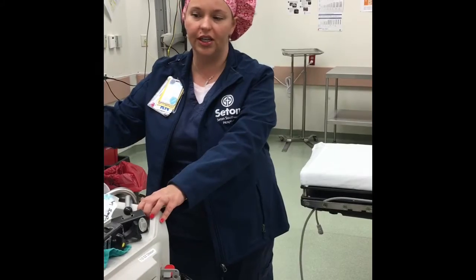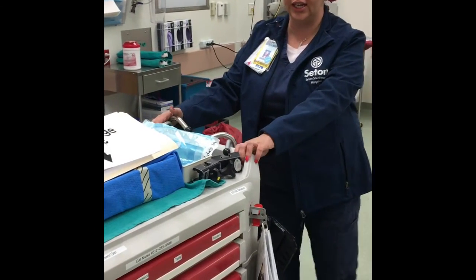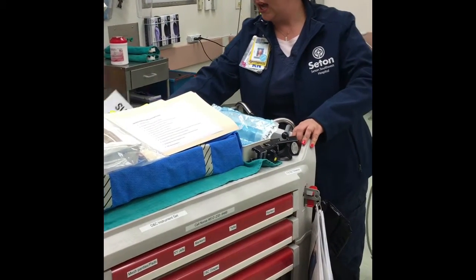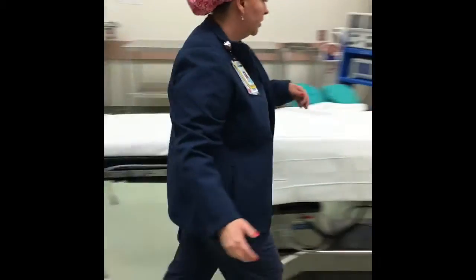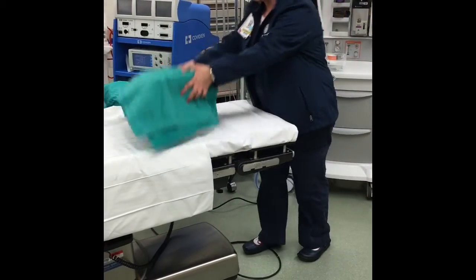Okay, so you're gonna gather your supplies that you need to get ready for the case. You're gonna get the suction D&C cart that's out in the hallway. And the first thing you're gonna do is get your bed ready. So you're gonna remove the headpiece.